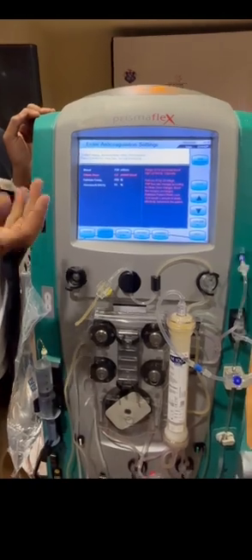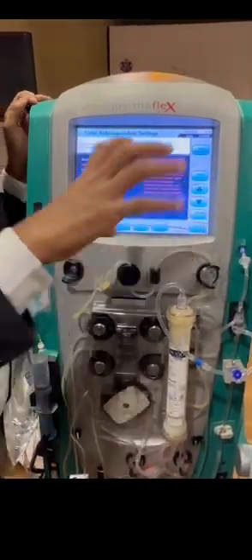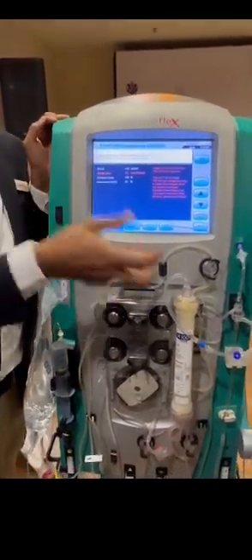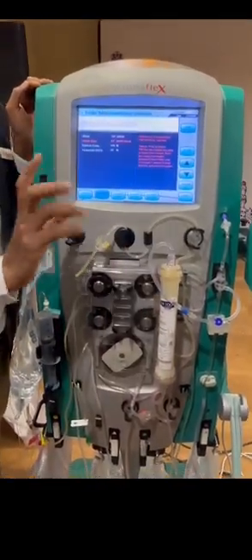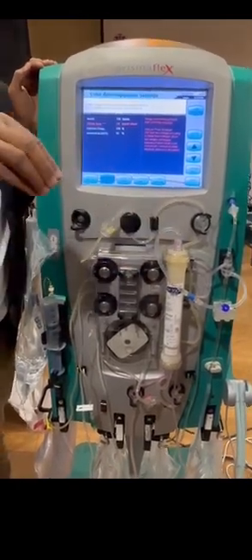If you are giving 3 millimole per liter, that will be adequate anticoagulation. Okay, but still we have to check the calcium and adjust this. If the filter calcium is increasing, we have to increase the citrate dose. If the filter calcium is decreasing, that value I will tell you. The filter calcium will be in between 0.25 to 0.5.